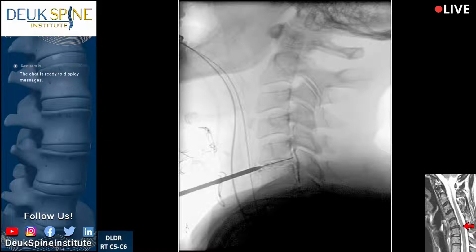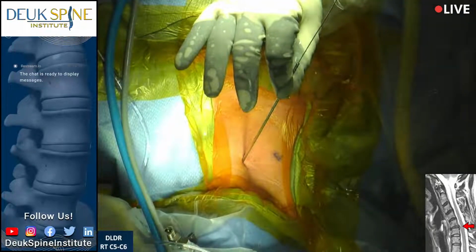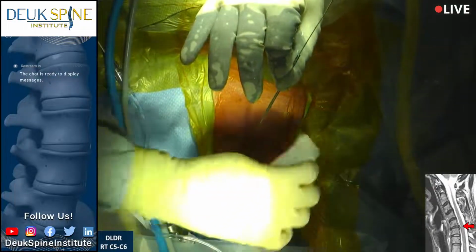All right, good. For some reason, the lighting is casting shadows. Can you, Berndes, can you put the light here, please? Thank you. All right, there we go. Can you guys see this incision here, or where the tube's going in? You see that, Henry? Yes, we see it. All right. Good. Let's get an AP.